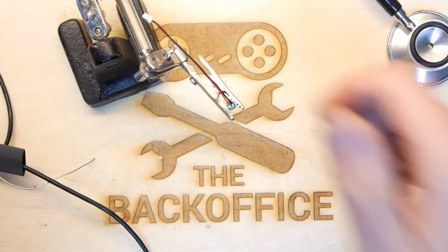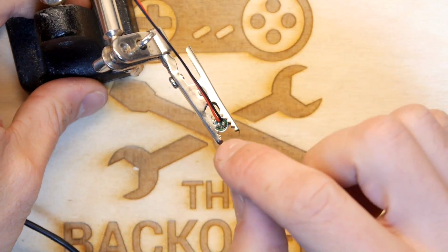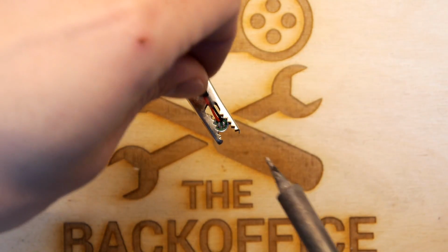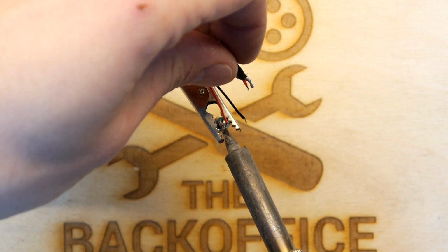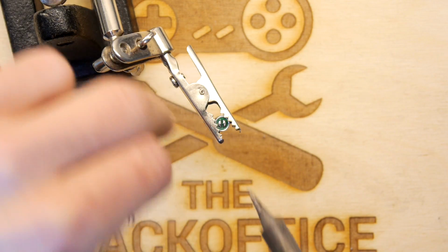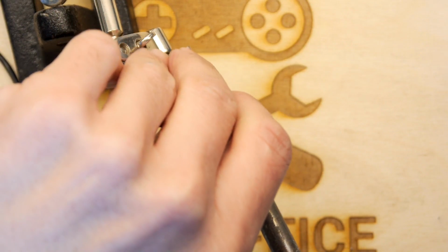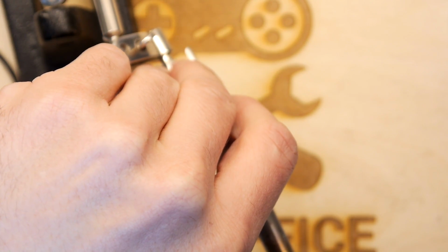But I have to make sure I keep an eye on that polarity. I don't want to get the polarity wrong. So that's the ground, the minus, and that's the plus. And in fact, I can see on the device itself a small plus, so that's really handy. You probably can't see that on the camera, but there is one there. Just going to attach our new wires.